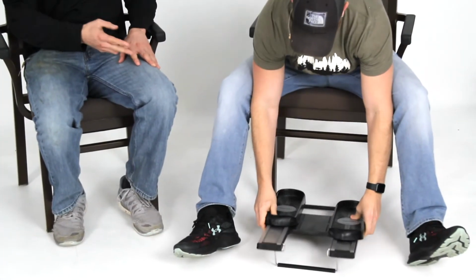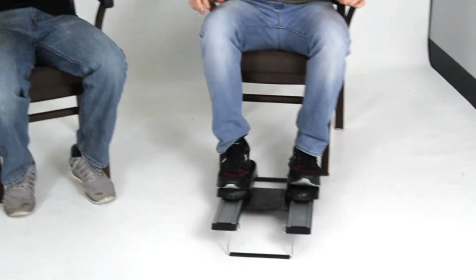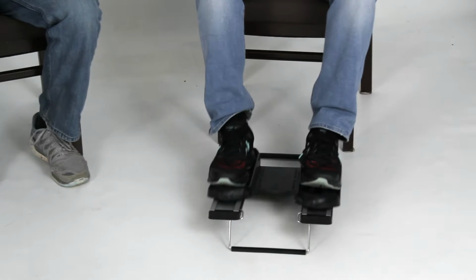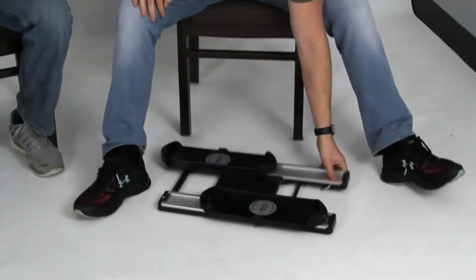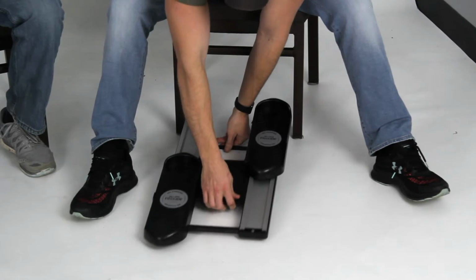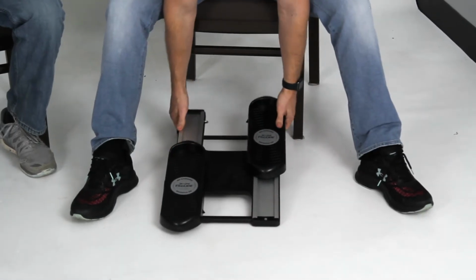Quick, here, there are three ways you can do it. Mike's going to put it at an incline. We call this an incline right now. These three ways depend on what your goal is. Mike's going to turn sideways, a side profile for you. So we have incline, flat, or a decline. The decline is the same as the incline, you just set it up the opposite way.